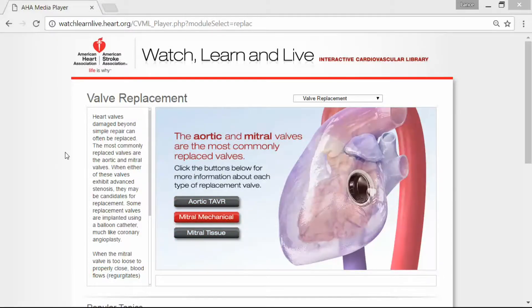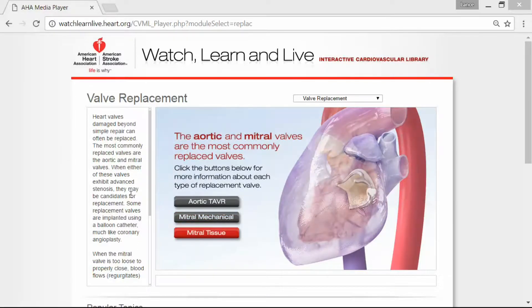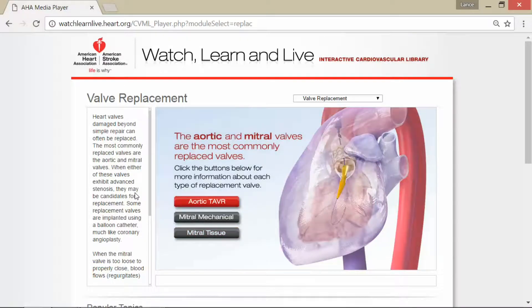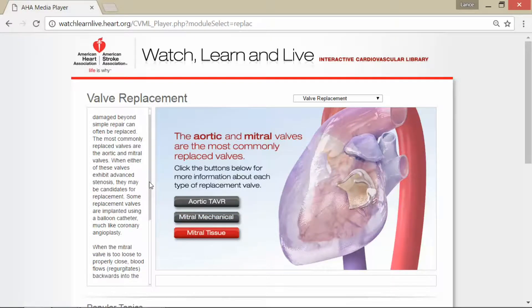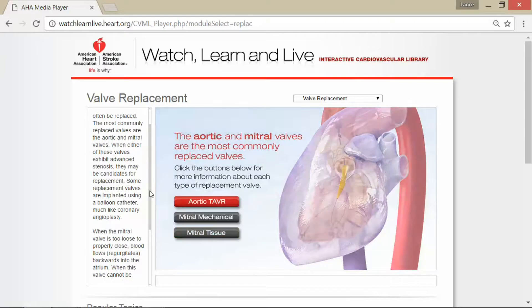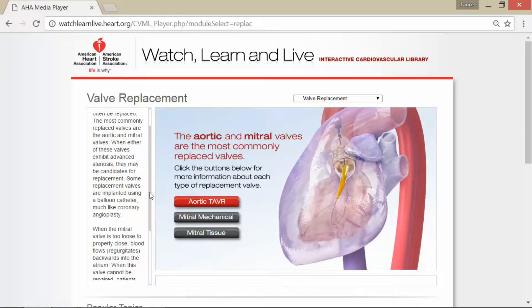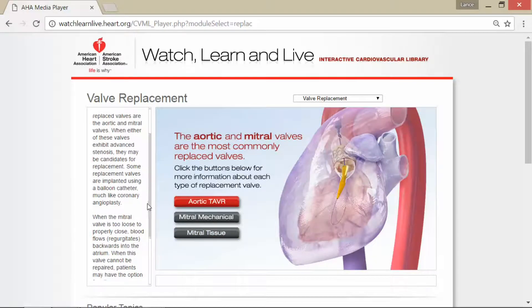Heart valves damaged beyond simple repair can often be replaced. The most commonly replaced valves are the aortic and mitral valves. When either of these valves exhibit advanced stenosis, they may be candidates for replacement, and some replacement valves are implanted using a balloon catheter, much like coronary angioplasty.